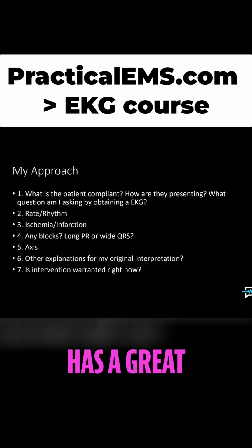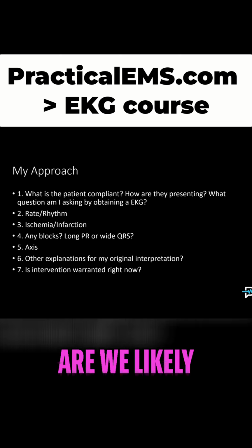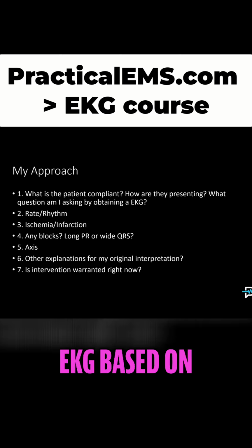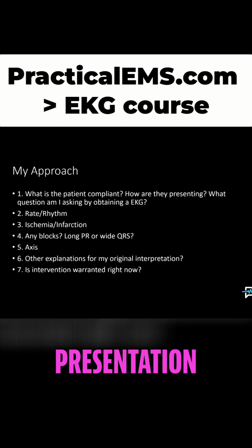And if the patient has a great blood pressure, if they look not sick, are we likely to find something on the EKG? Probably not as much as if the patient looks very sick and has a very poor blood pressure. We might find something more pertinent on the EKG based on the patient's presentation.